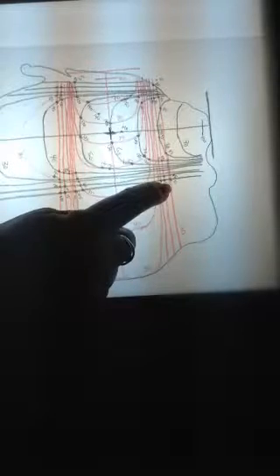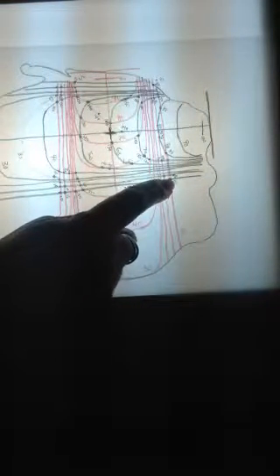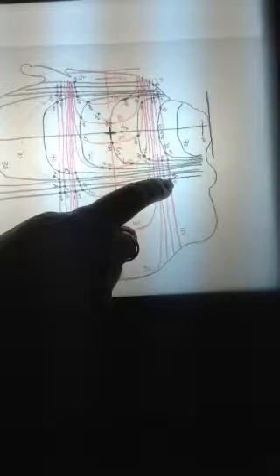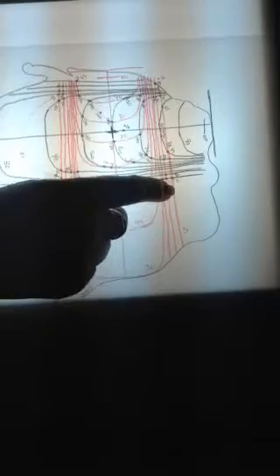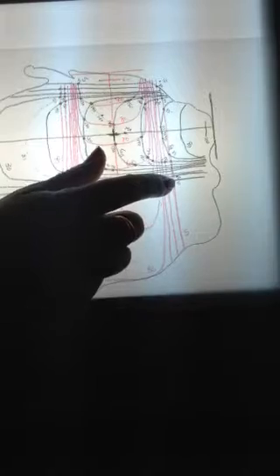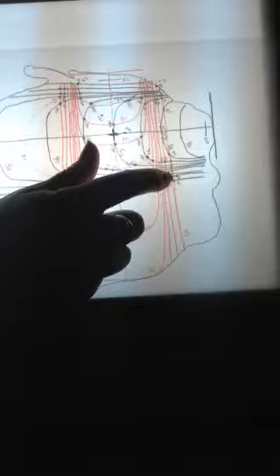The next step then would be to add dose lines, because what is actually happening is you're seeing an accumulation of dose. So for example, here where the red line crosses the black line, this red line represents 5%, that black line represents 5%. So at that intersecting point, this represents 10%. Okay, so we could follow the 5% line up, over, and across the black lines and start adding doses. I only represented a few dose points in here. I want you to do the rest of it on your own.